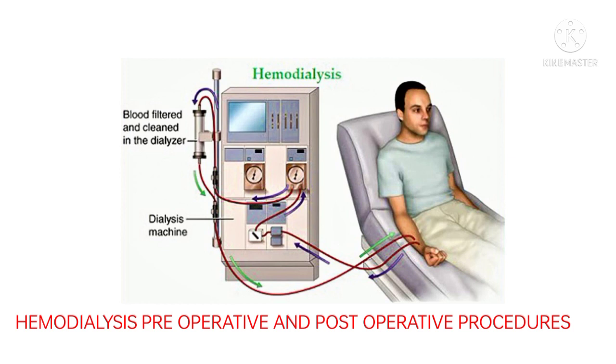Longer-term catheters that are tunneled and cuffed are used if temporary access is required for longer than 3 weeks. Unfortunately, they are easily infected and are associated with a high incidence of venous stenosis. Strict aseptic technique must be used during insertion, and dressing changes are usually performed by a limited number of trained nurses. Subclavian vein placement is the least preferred because of the risk of pneumothorax.